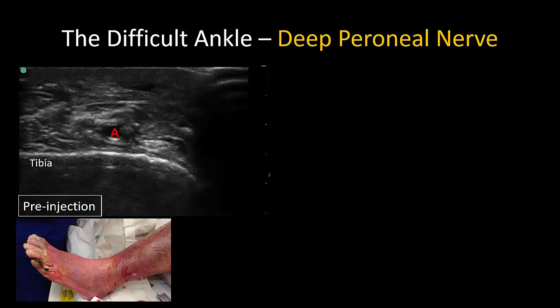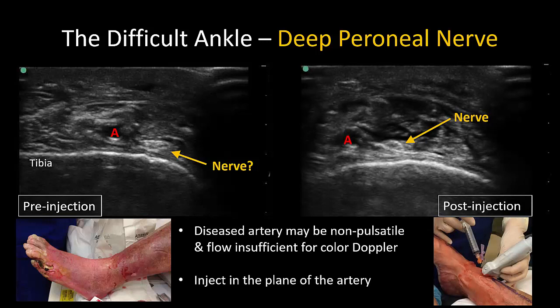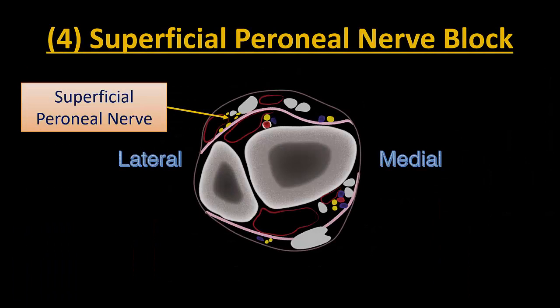In the edematous ankle, the artery is superficial enough that it can always be visualized. In vascularopathic patients, however, pulsatility may be faint or absent, and color doppler will not help either due to the low flow state. Instead, it has to be identified by pattern recognition. The deep peroneal nerve will be somewhere nearby, and it is sufficient to flood the area around the artery to anesthetize the nerve.